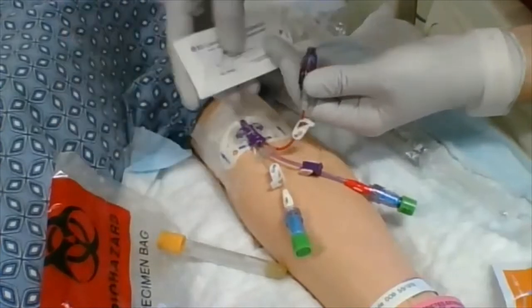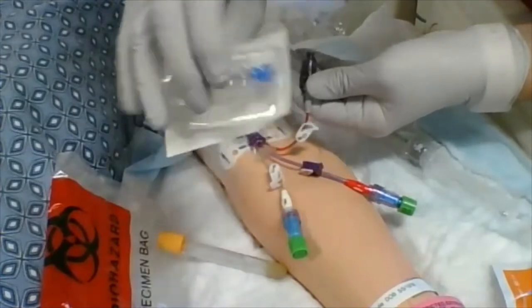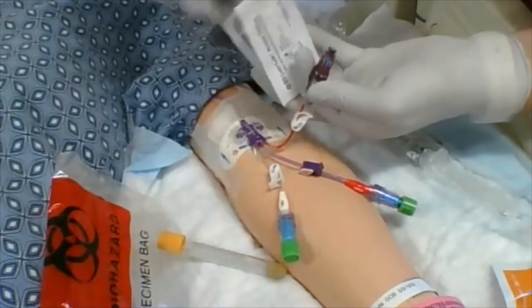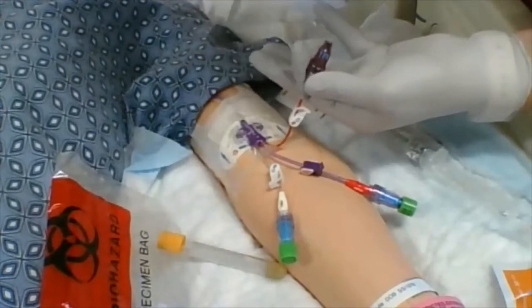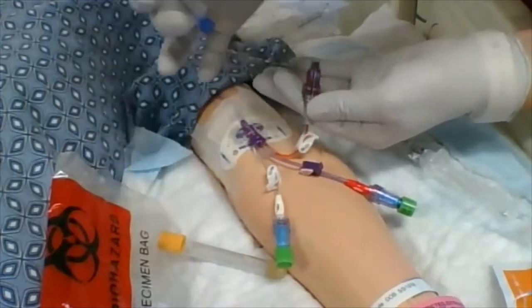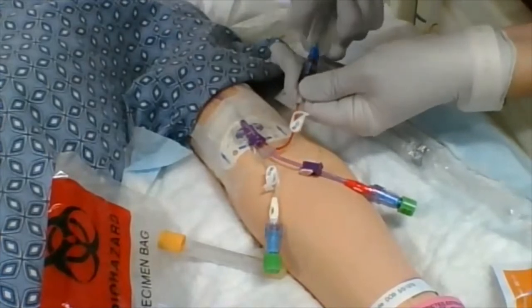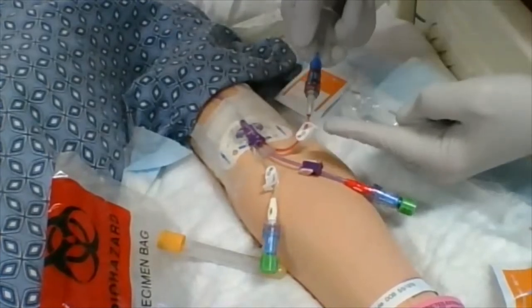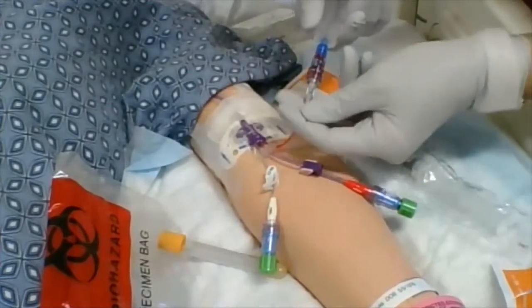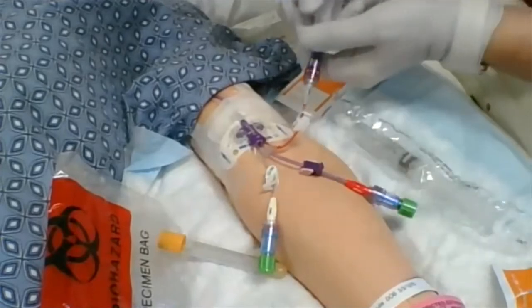You're going to use your Luer Lock Needleless Vacutainer — it looks like this and usually has a little blue connector on it. Be careful — never, never, never put your fingers inside here because there is a very sharp needle in there. I've already cleaned the hub with alcohol, so I'm going to connect here. My pigtail is still clamped — once I feel nice and secure, I'll unclamp.